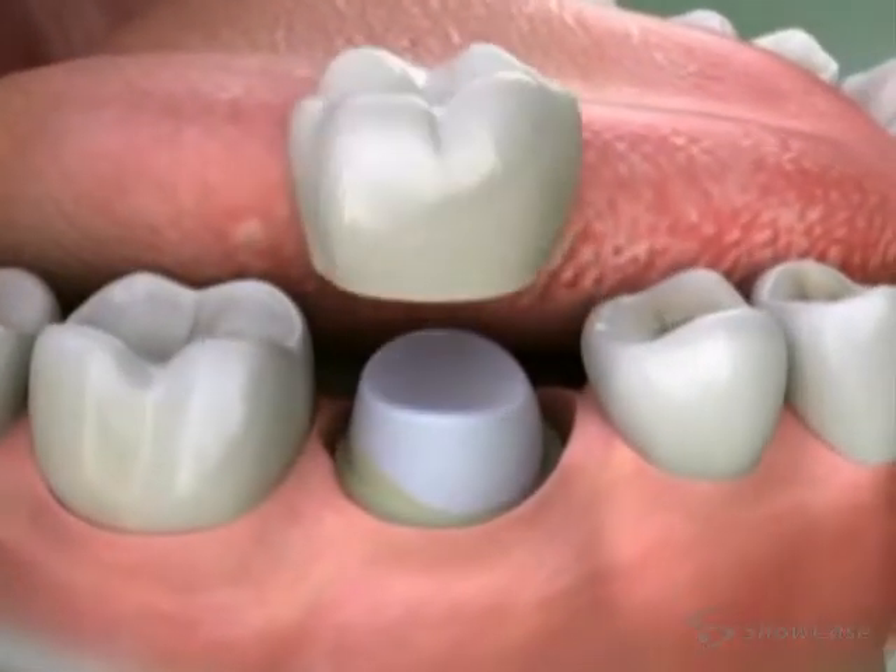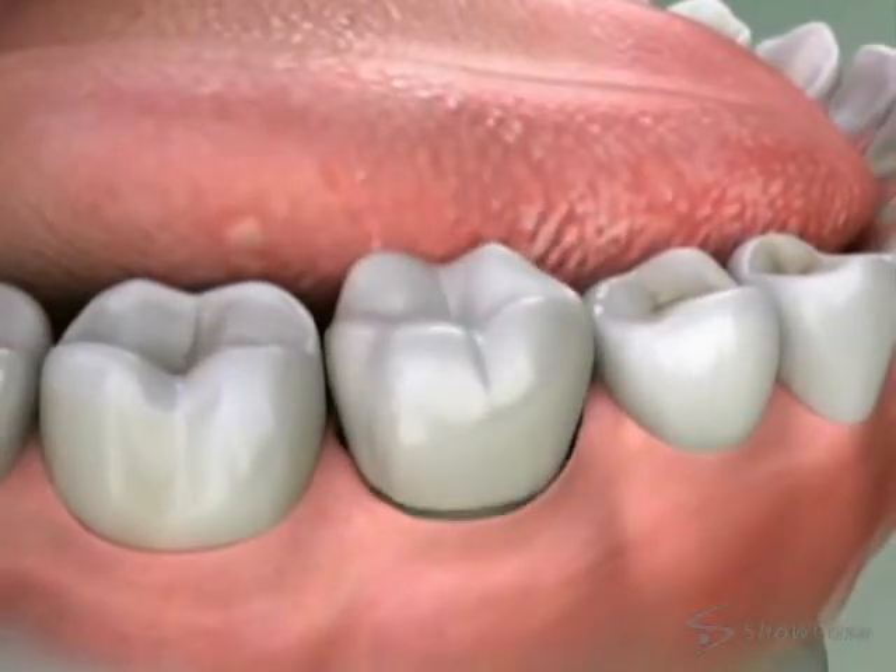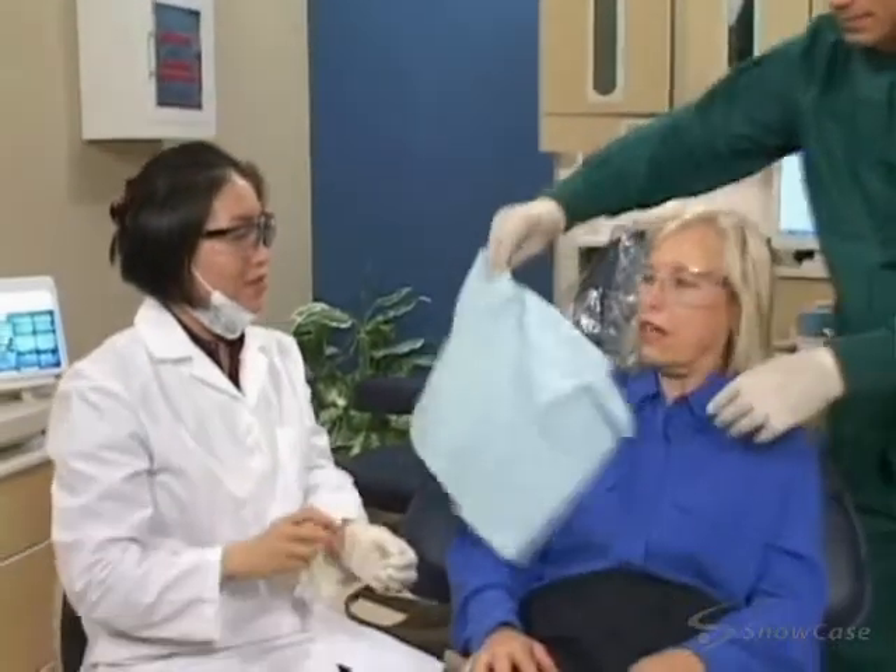And finally, we place a crown to protect and strengthen your tooth. Root canal therapy saves your tooth and gives you back your healthy smile.